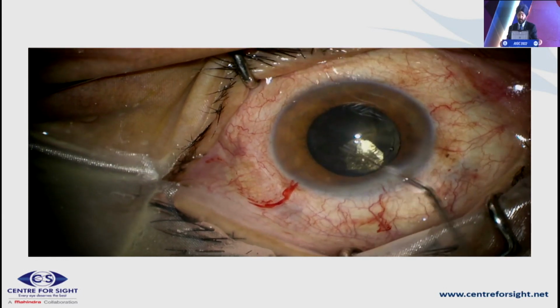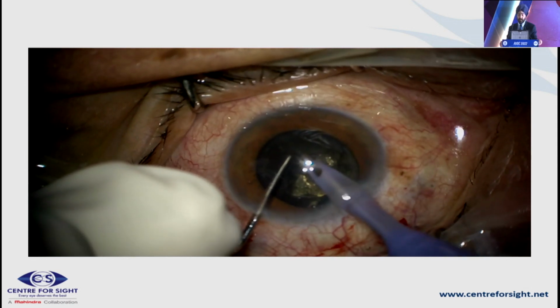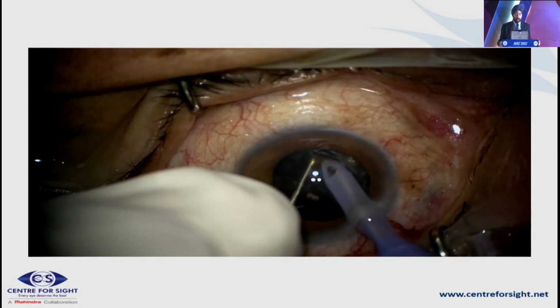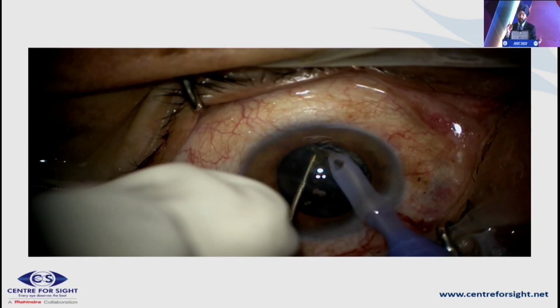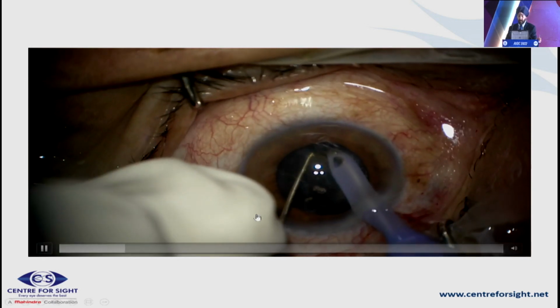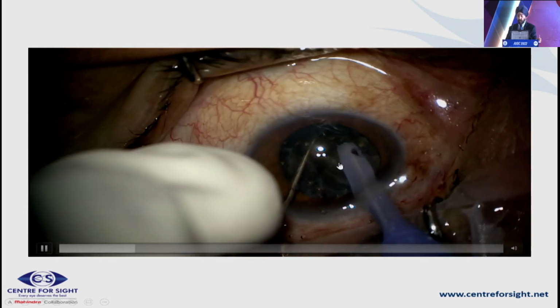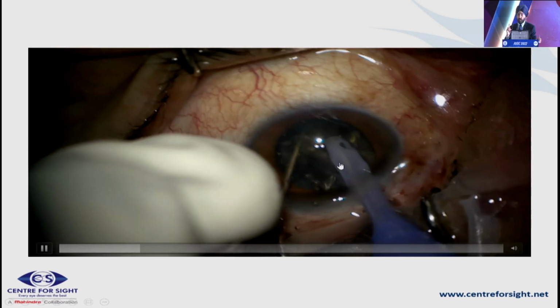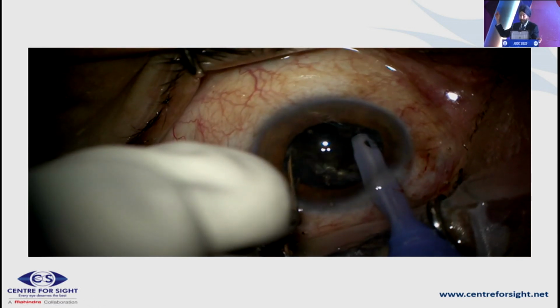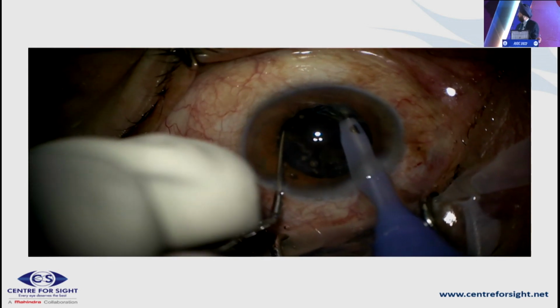So this is a much harder nucleus. We have made a bigger capsulotomy, which is a 5.2 on femto, which actually would become about 5.5. Now again, you can see I have sculpted, though there is a pre-cut. I'll just show you that there is a pre-cut which happens even in a black cataract. Can you see these bubbles that came out? What do these bubbles show? These bubbles showed that the femto laser has been able to penetrate, and again you can see that this is a black cataract, blacker than what I showed you earlier, and we were able to split it in the center.